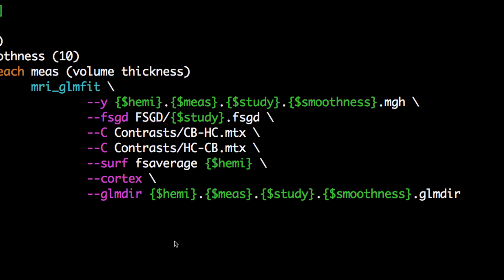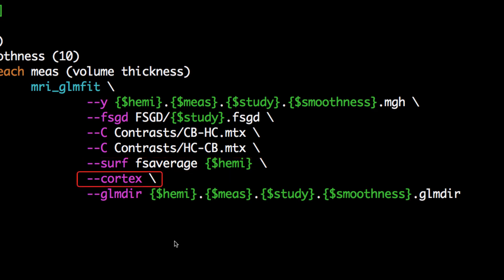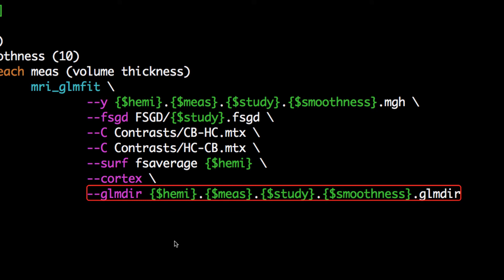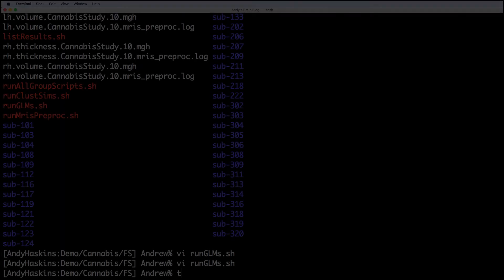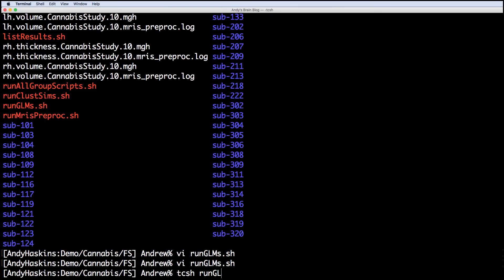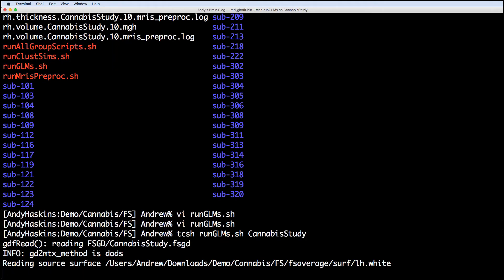Lastly, the surf command means to run the analyses on the surface of the FS average template. Cortex means to only run the model and contrasts on the cortex, and then we output the contrast files. Run this command by typing tcsh runglms.sh cannabis study.